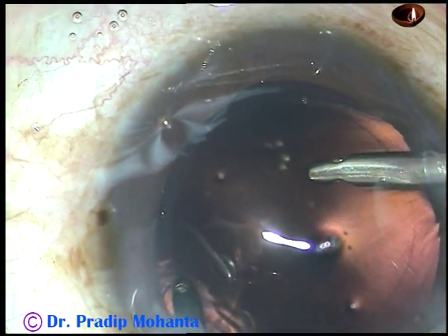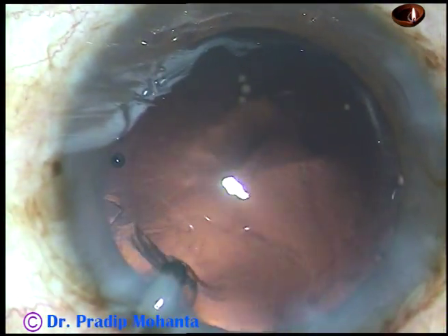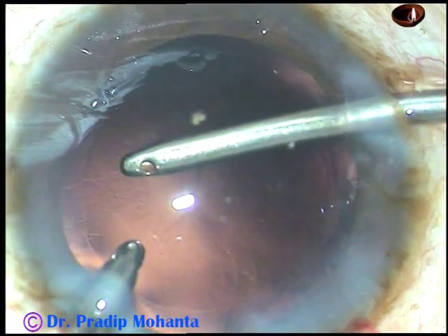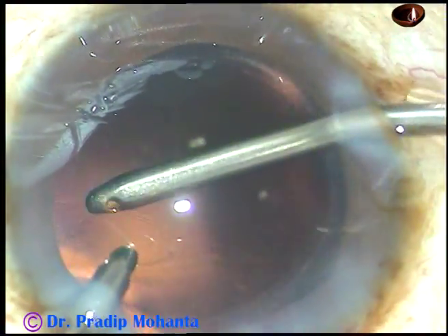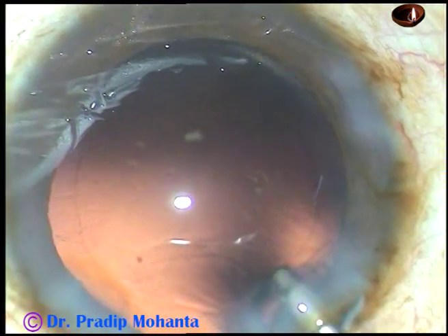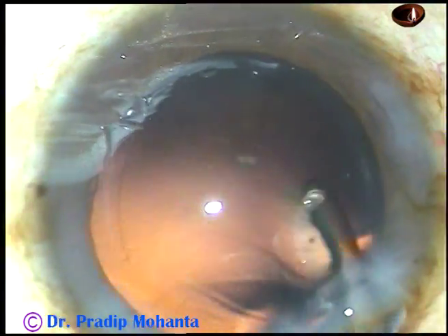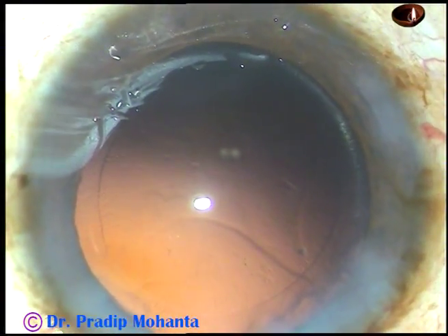In this case I didn't use the Simcoe through the side ports because the side ports were smaller and it would not be possible to introduce the Simcoe through them. Cortex has been removed. Now I am in IA2 mode where the vacuum is very low at about 20 mmHg and the flow rate is also 20 ml per minute. I did some polishing with the IA2 mode, also called capsule polish mode, and hydropolish using the irrigating probe for polishing the posterior capsule. The posterior capsule is quite clean now.